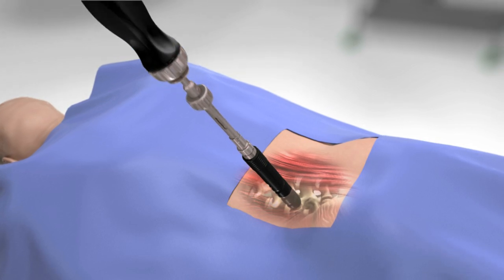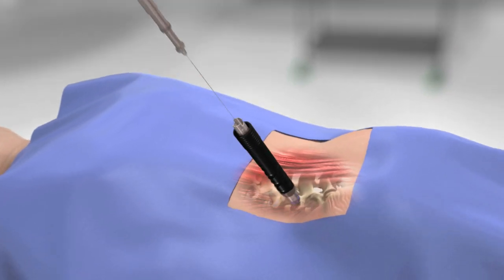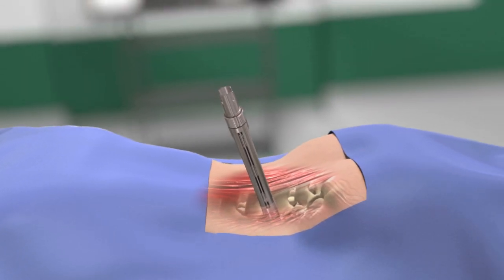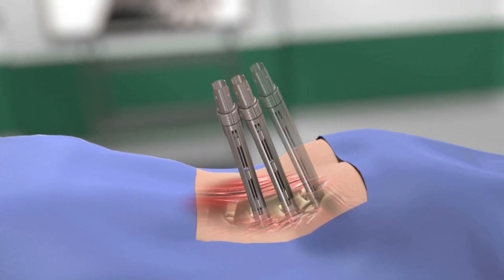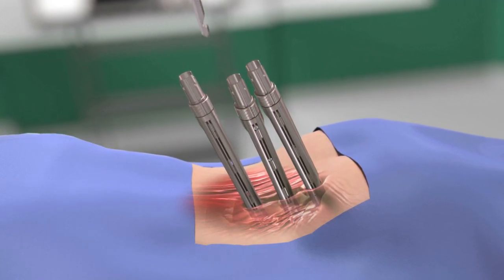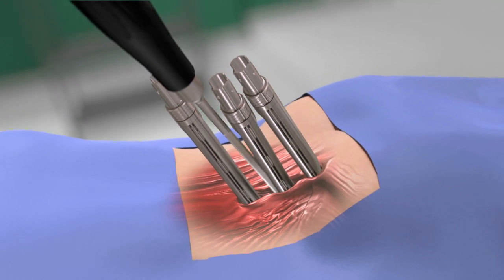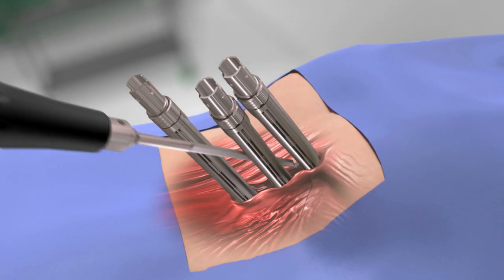When pedicle screw insertion is complete, remove the driver and dilator four, leaving the screw and extension in place. Repeat this process for all levels to be instrumented. When all pedicle screws are in place, dissect a tissue plane between the screw heads to create a pathway for rod placement.